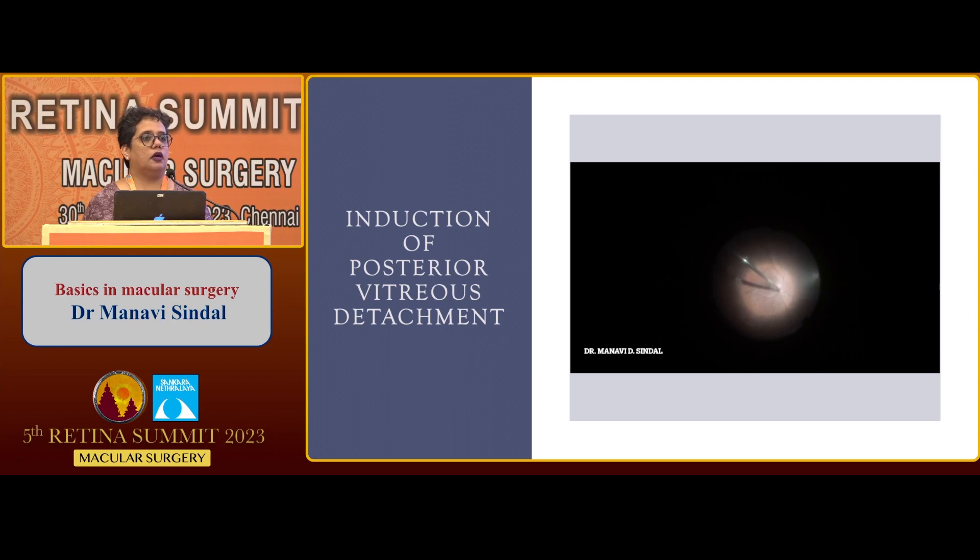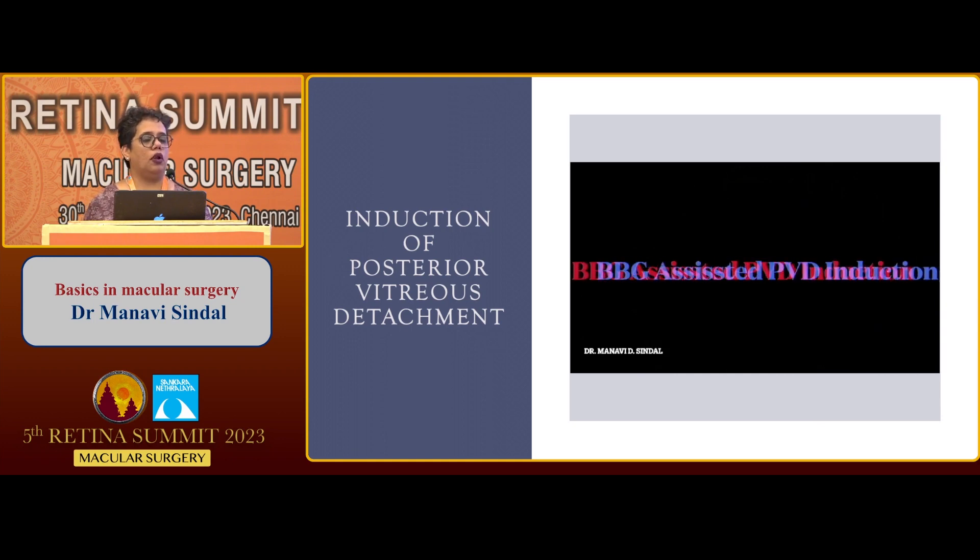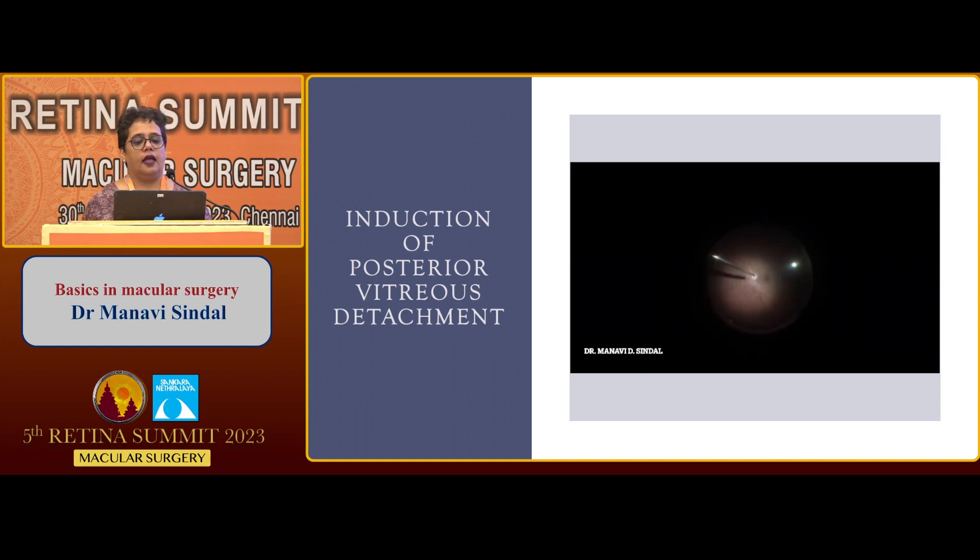Triamcinolone acetonide crystals stick to the vitreous, making it very easily visible and making the induction of posterior vitreous detachment easier. Triamcinolone is also used to stain the vitreous to ensure complete removal even in anterior vitrectomy or when dealing with pediatric eyes. Here you can see the IVTA-stained vitreous easily detaches and comes off, and by the easy visualization we can also see the hyaloid coming up. Sometimes IVTA crystals, especially in macular holes, can get deposited within the hole, which can be quite unpleasant.